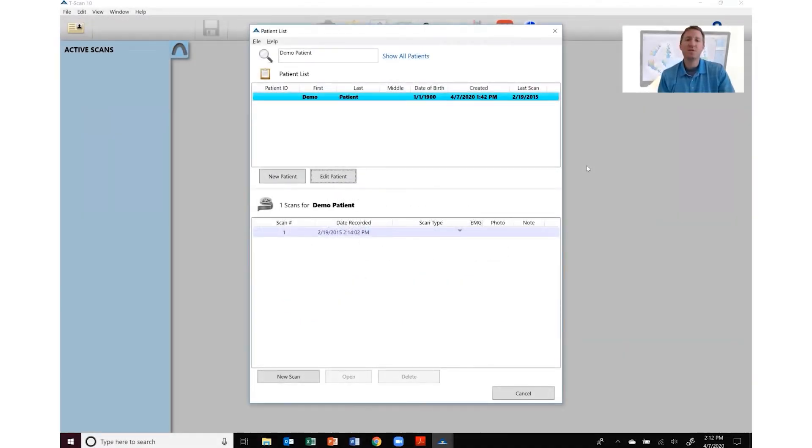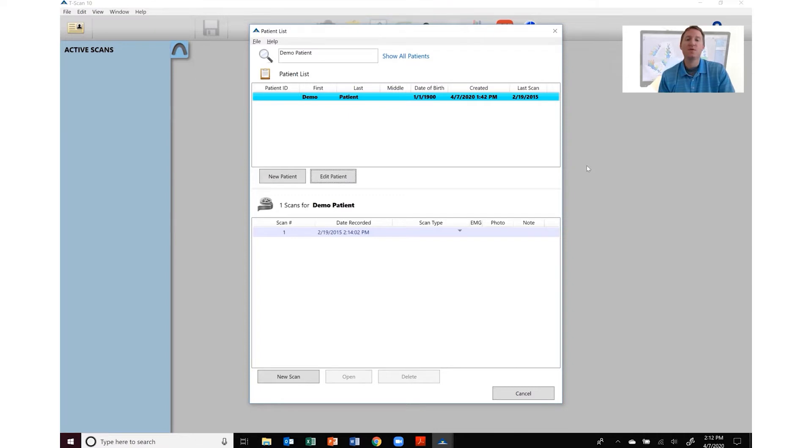Hey everyone, Shane here with TechScan. In this video I'm going to show you the steps to import a digital impression overlay into your Tscan software.